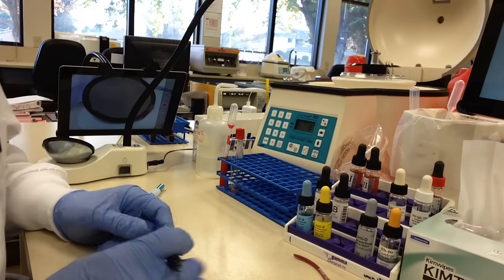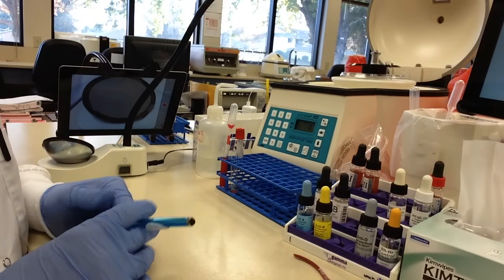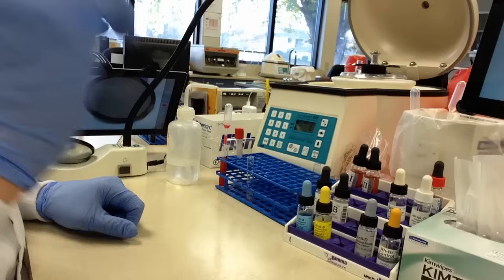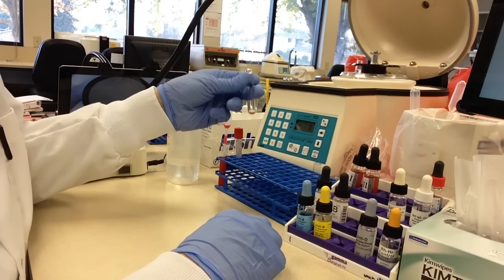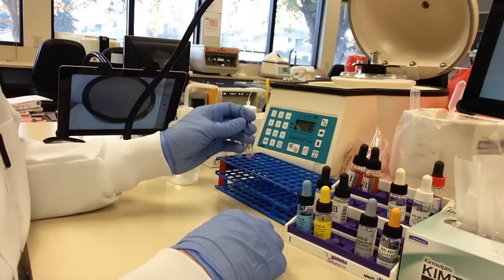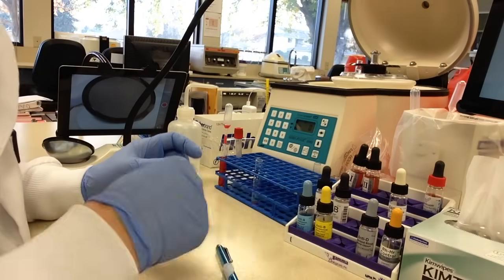Now the next step is to do our wash phase — I'm going to turn the camera off and come back in a few minutes because we have to do it manually and it takes some time. I have gone ahead and decanted my last wash. Basically what I have in the bottom of the tube is just cells and very little liquid. So now we are going to add our two drops of anti-human globulin.